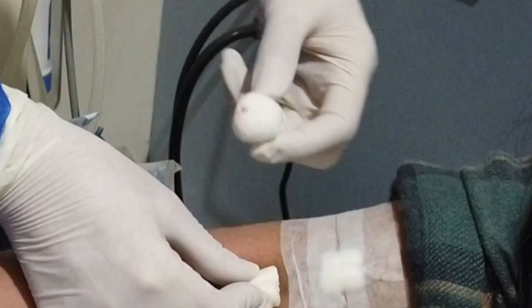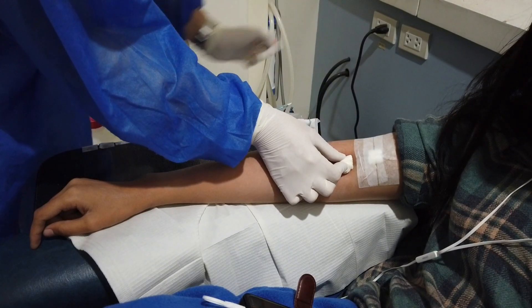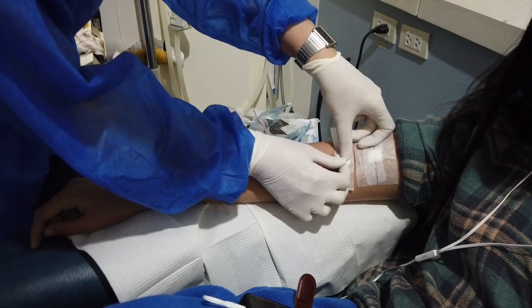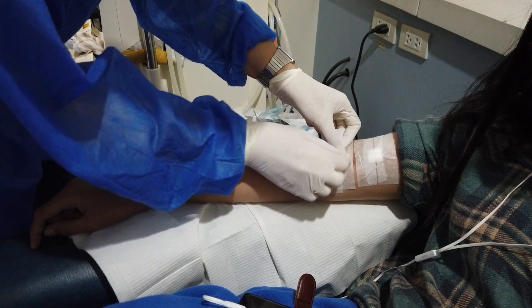Once there's no blood anymore on the PD, I then change it to a flat PD. Previously in my hospital workplace, we used a 2-inch tape that fully covers the flat PD. If not, I improvised with 3-inch tapes — first to secure the flat PD, then double it with 2 tapes overlapping each other.